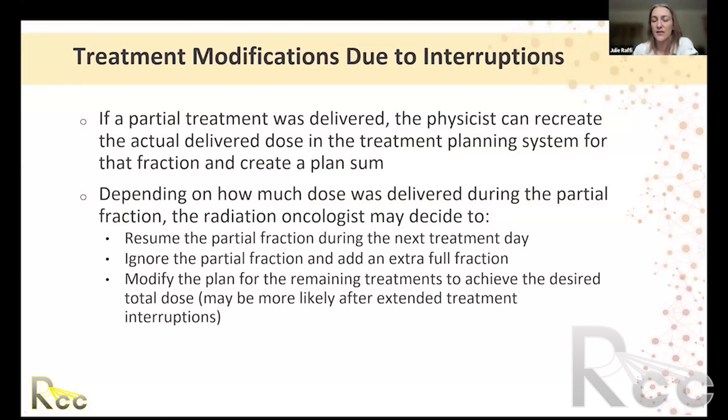So if you do have a partial treatment delivered, the physicist can recreate the delivered dose in the treatment planning system if that's something that will be helpful for the physician to decide how to proceed. There are different options depending on how much dose was delivered.